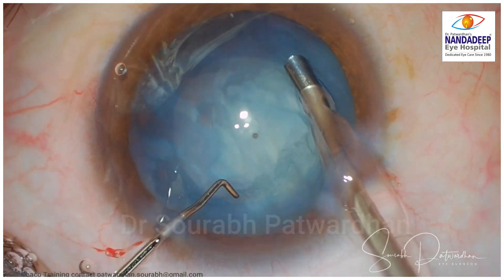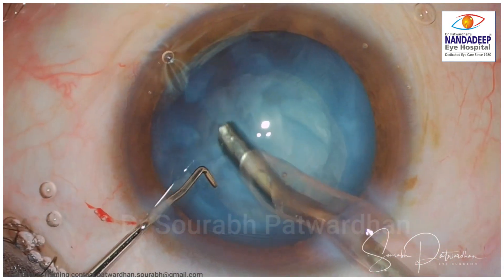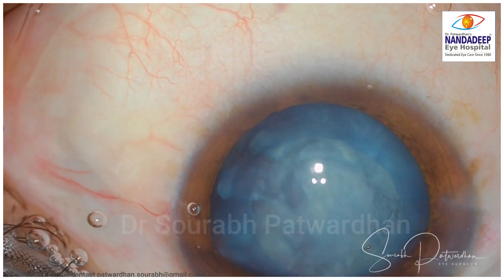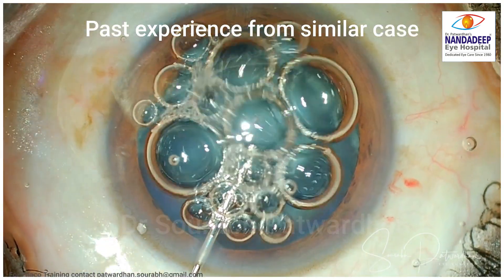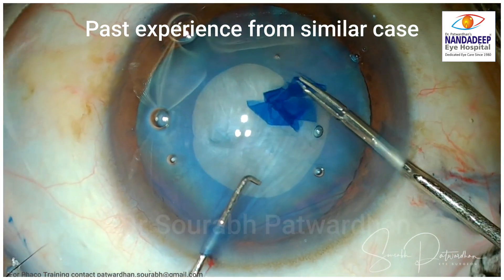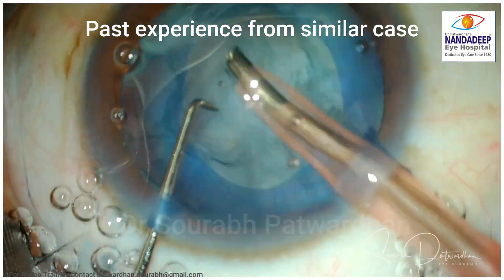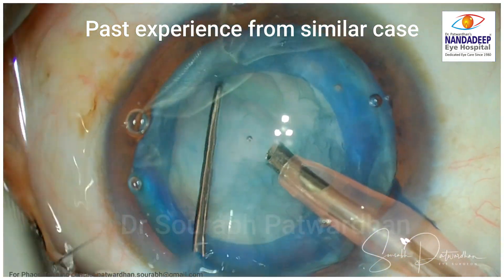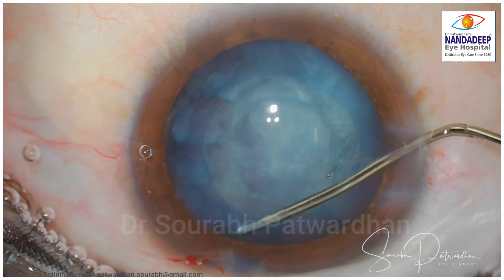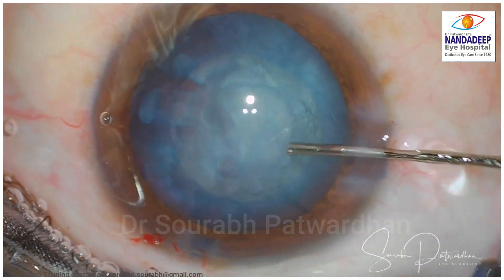Here I am trying to rotate this nucleus but it is not rotating, and I am trying to aspirate the nucleus which is very soft. I am a little concerned why the nucleus is not rotating. In similar cases where it is a white cataract, we generally expect that the nucleus rotates very easily even without any hydrodissection. I know the pattern which should be followed here and it is not following the pattern of easy nucleus rotation. So I decided that I will now do some hydrodissection.